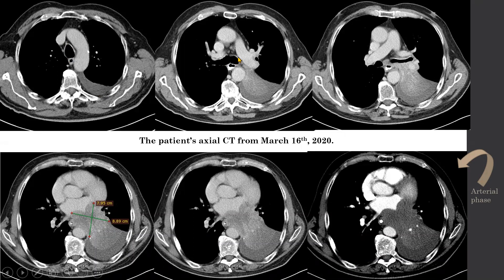At the level of the carina, you can see the right and left main stem bronchi branching off, the esophagus, and again the pleural effusion. A demarcating line separates the pleural effusion from the left lung lobe atelectasis. The aorta and esophagus are also identifiable, and the right and left main bronchi can be seen branching completely.